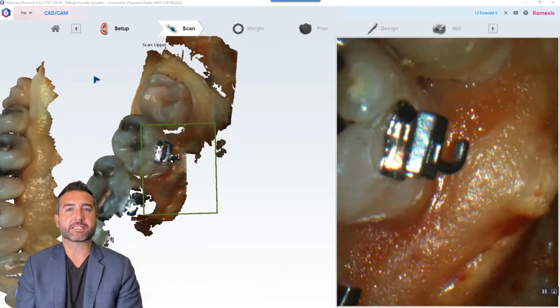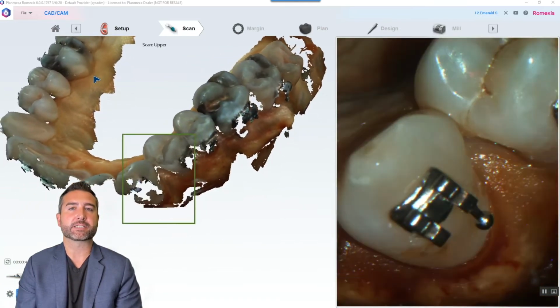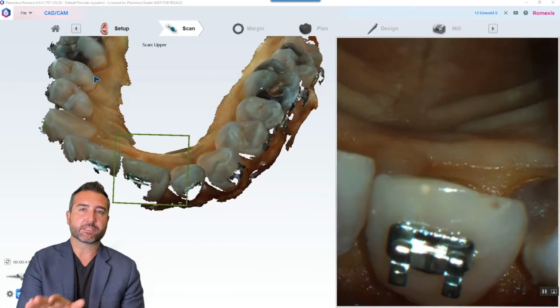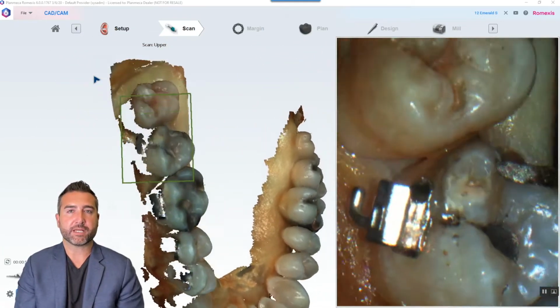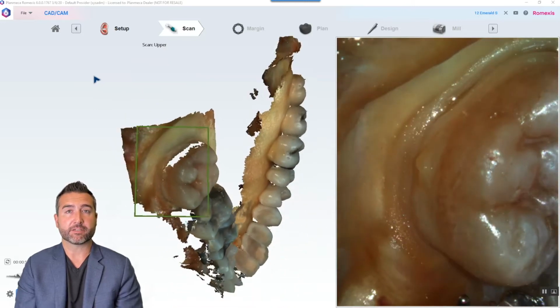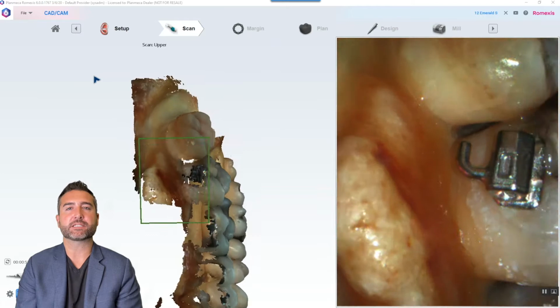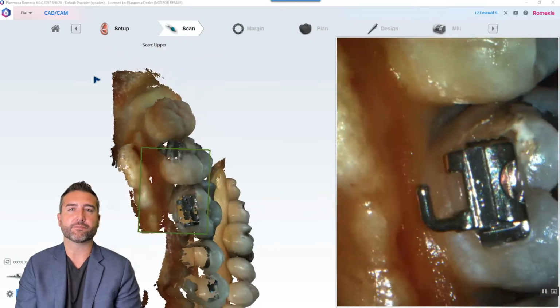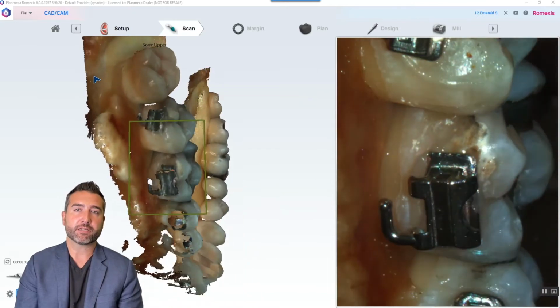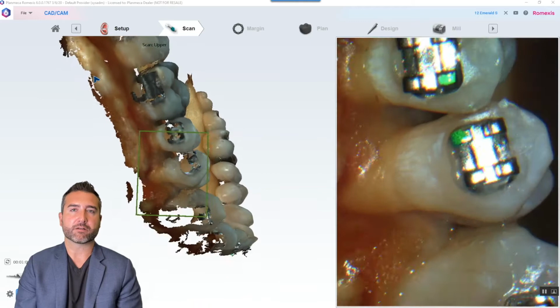The 4th pass is going to be the buccal at about this 45-degree angle here. So you can see we're getting the brackets and the incisal edges, occlusal surfaces, kind of overlapping previous scans. The way that these scanners are the most accurate is if you constantly overlap data. And then lastly, it's the facial surface at about a 90-degree, kind of flat-on angle, filling in and rotating around those brackets and getting kind of underneath those bracket arms and everything like that.